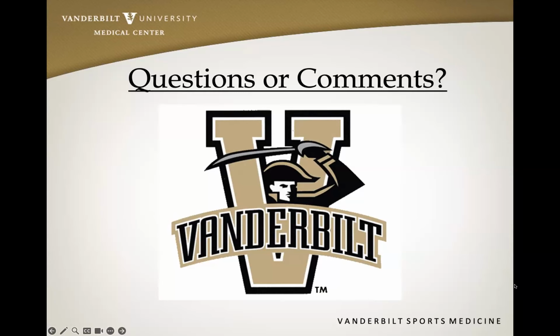And then it sounds like you're using absolute values rather than a stress delta. Yeah, so I'll scan both statically and then dynamically as well. In this case, I didn't get the exact measurements dynamically, but if it's a very close case, then I'll usually do maximum measurements when they go into ulnar deviation and compare it to where they were statically. And for that measurement, I'm classifying instability as anything greater than 1 millimeter difference from static to dynamic. Great.